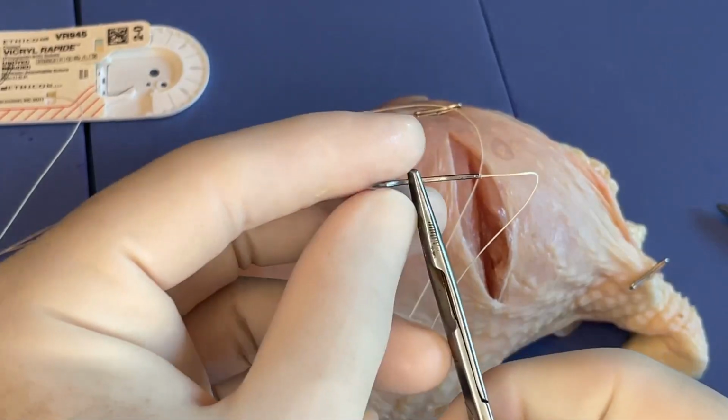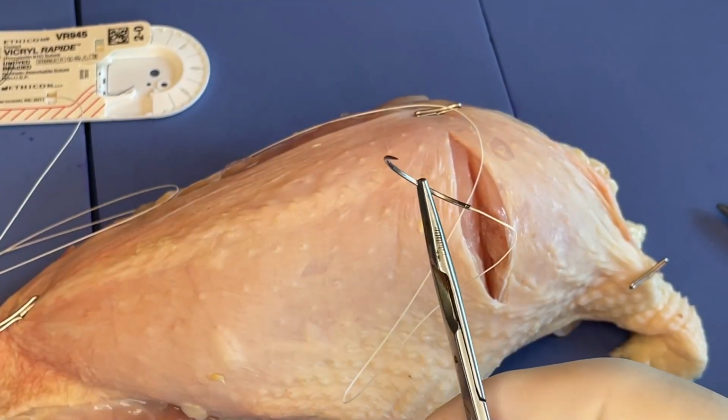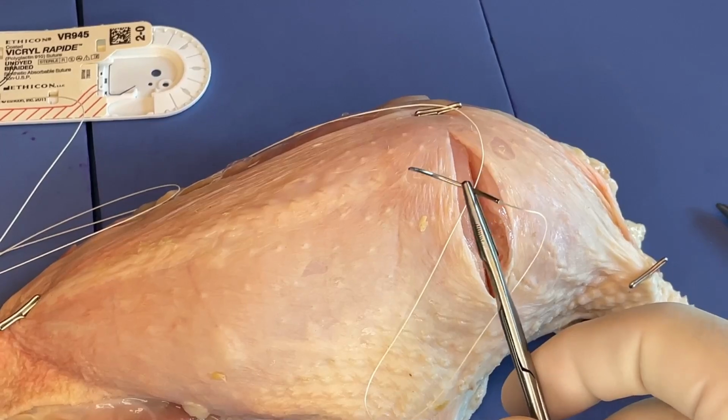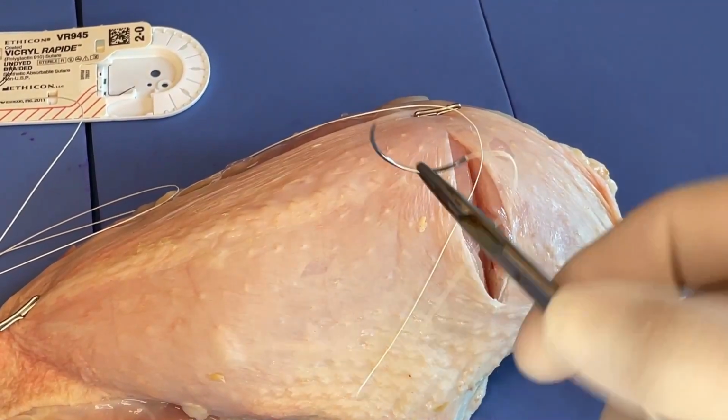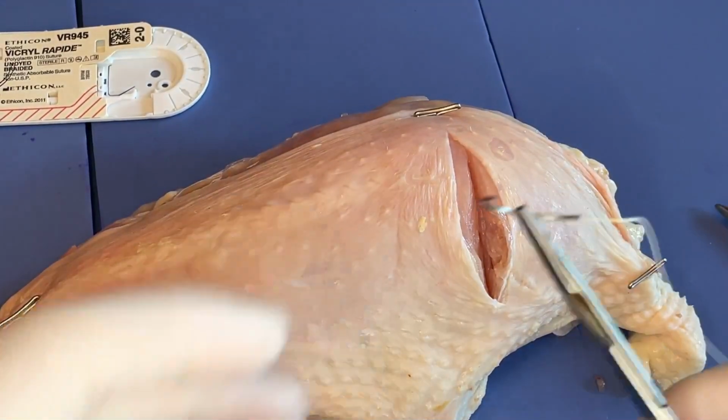One of the other things that we talk about a lot of the time is angling the needle at kind of 45 degrees like that. That allows you to get access to the tissue while keeping the needle driver kind of up away from the tissue, so to speak, and we'll see some examples of that.